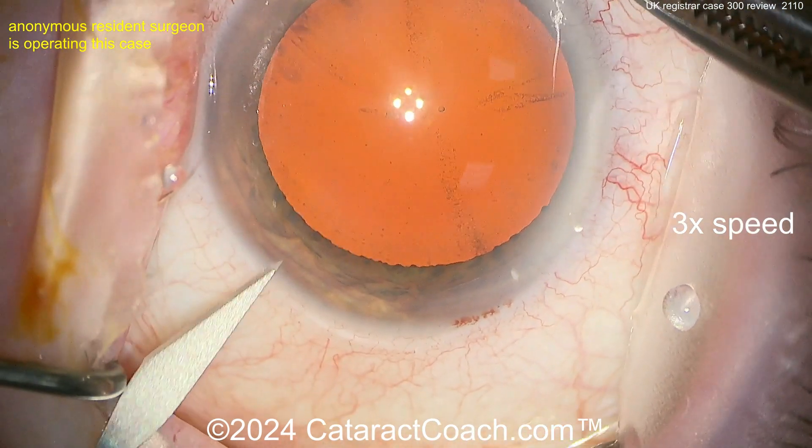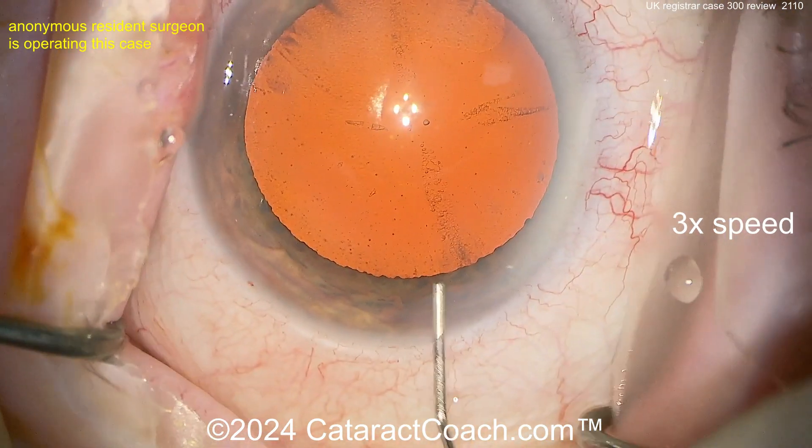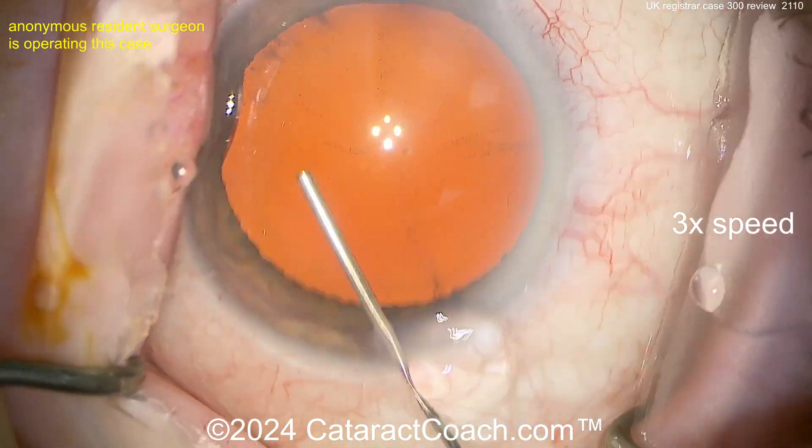This is cataract case 300. Nice little incision there — I like that nick of the limbal vessels, tougher to do with the eye full of just aqueous, but beautifully done. Lidocaine going inside the eye, and here comes some viscoelastic.